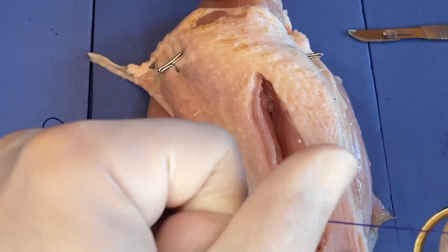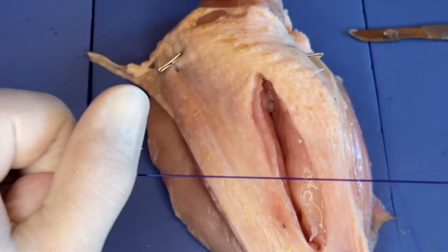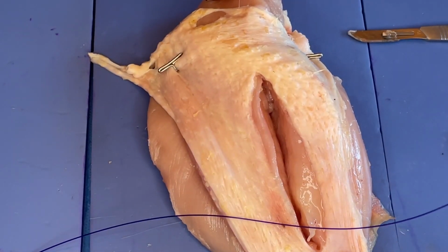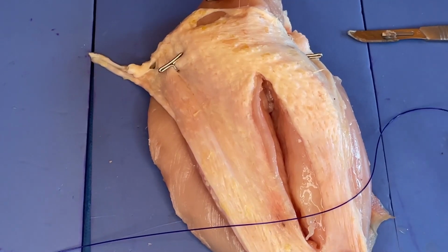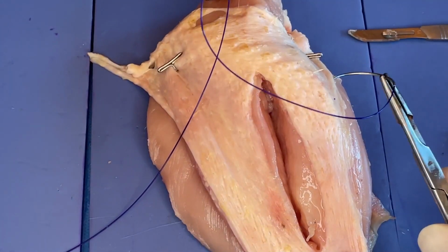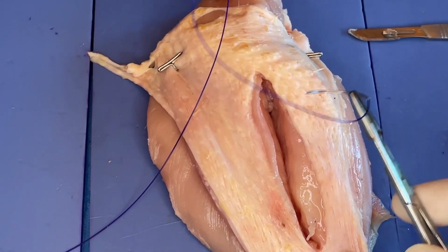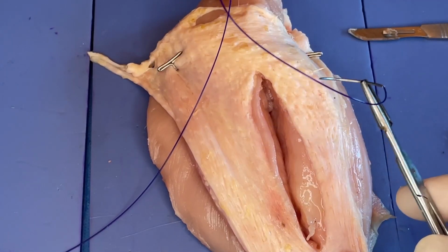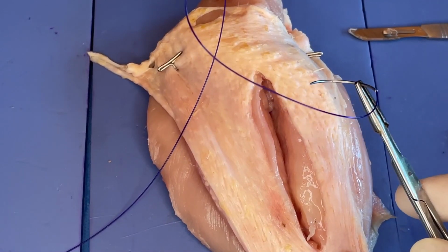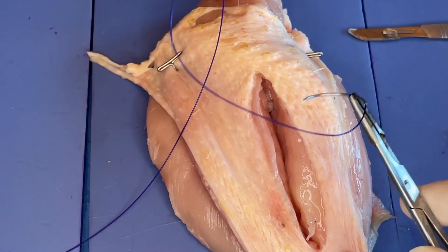One of the things you can do is to just run it through your hand, pull it, give it a little bit of tension, and that will tend to straighten it out a bit. But one of the things with PDS is that it requires 4 complete square knots, because of how thick it is, being a monofilament, having that memory, it needs very secure knots and a lot of them. So it's 8 throws, 4 complete square knots.